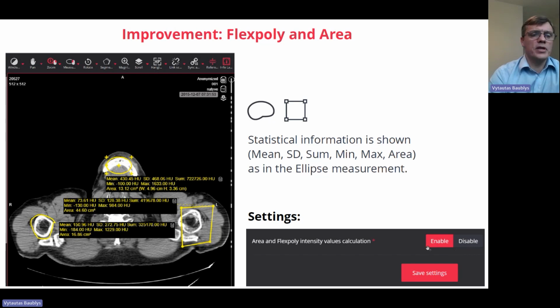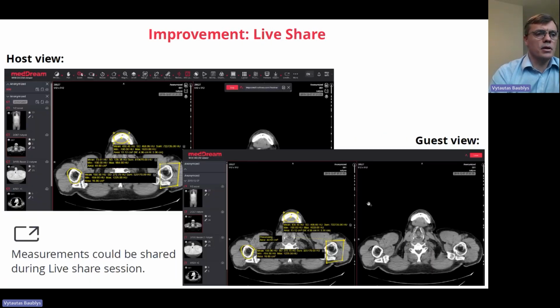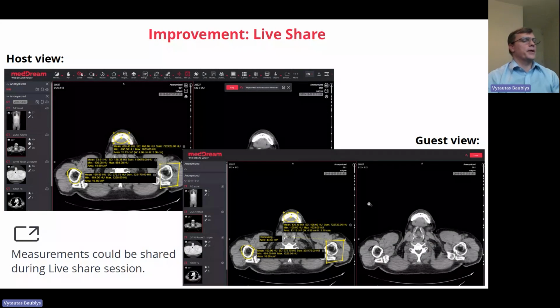The same was with the advanced features, which must also be enabled, which I showed previously. So if your settings are incorrectly configured for the new version, some of the features will not be available to you. So please note it for your support team so that they can check it.